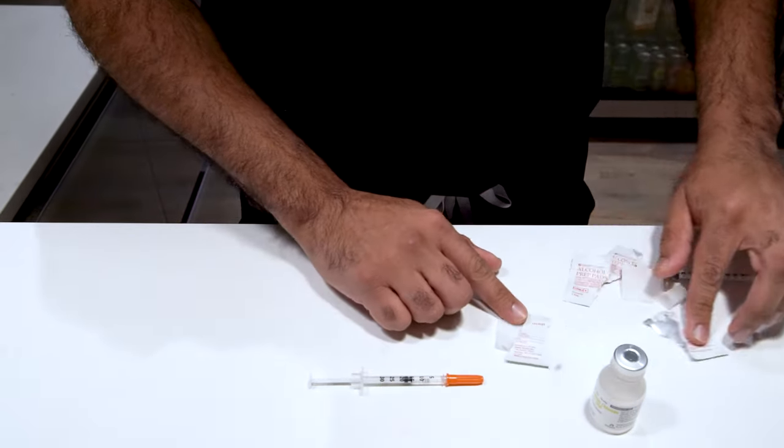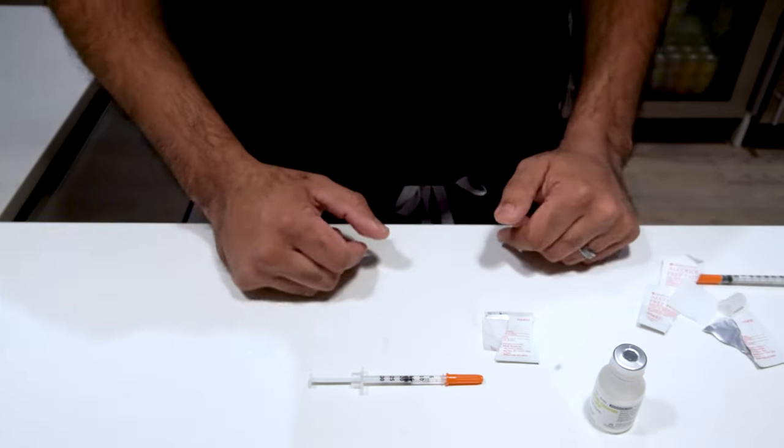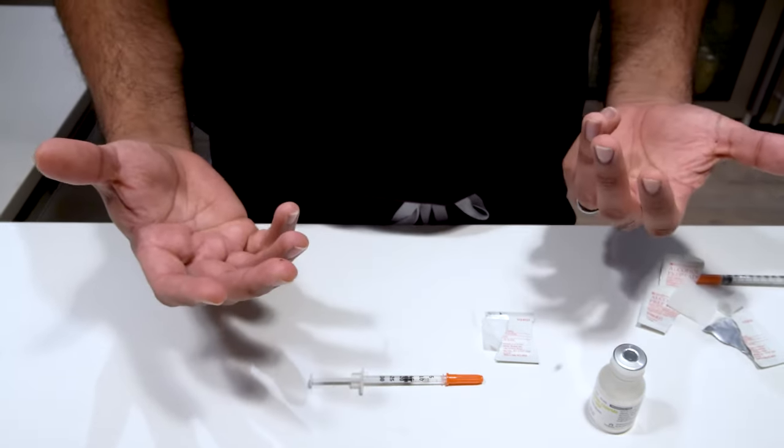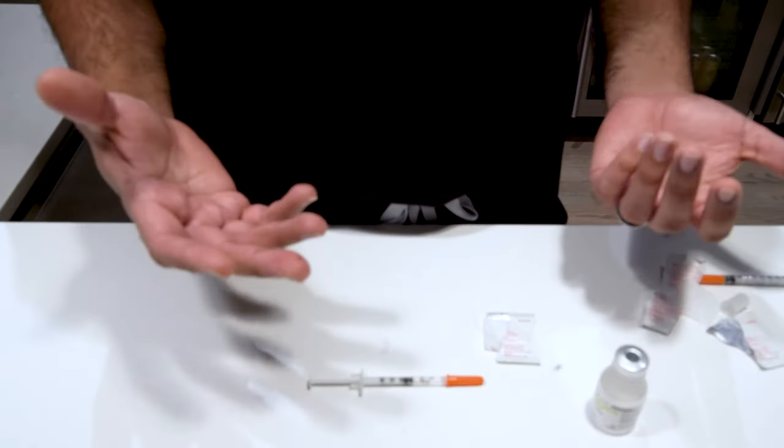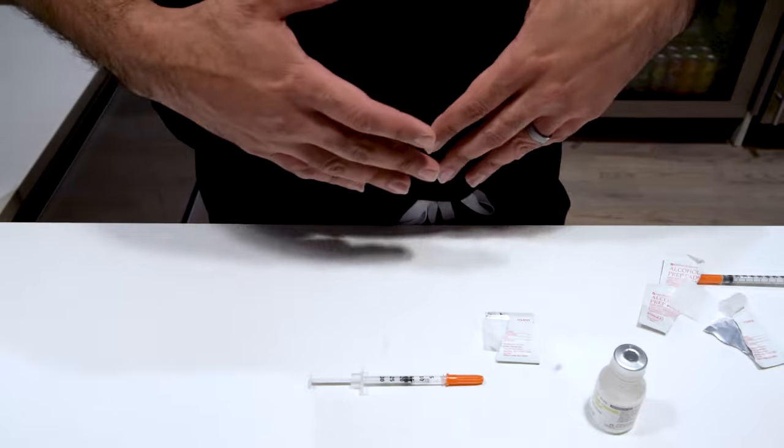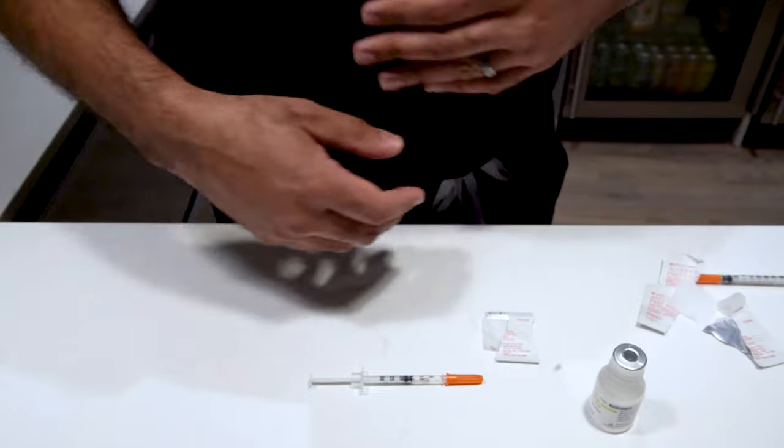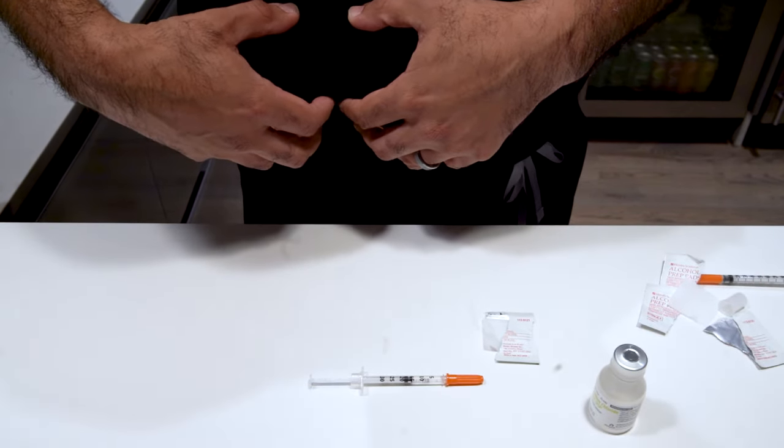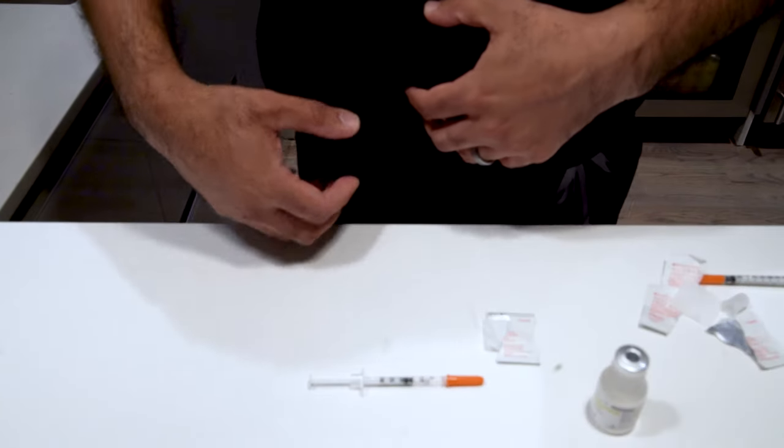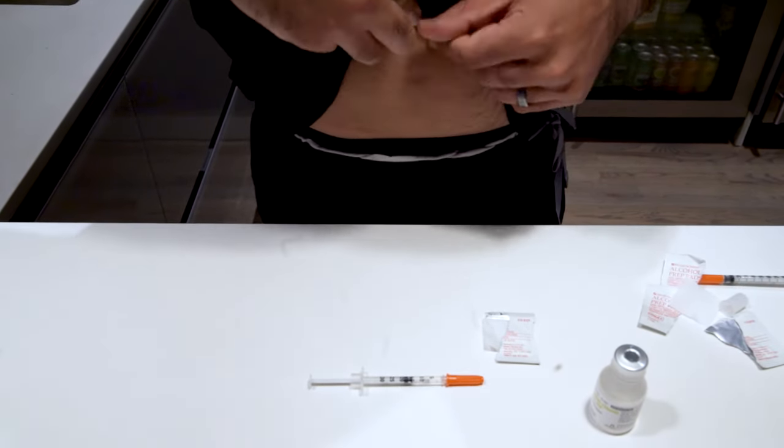Now I'm going to take my second alcohol pad and use that to prep my skin. Choosing a spot on your body to inject, this is totally up to you, but the principle is you want to make sure you have fat underneath the skin you inject. So a lot of people like using the abdomen, the love handles, the thigh, or even the upper arm. I find out for myself that it's a lot easier to inject the love handles because it's right off my side.